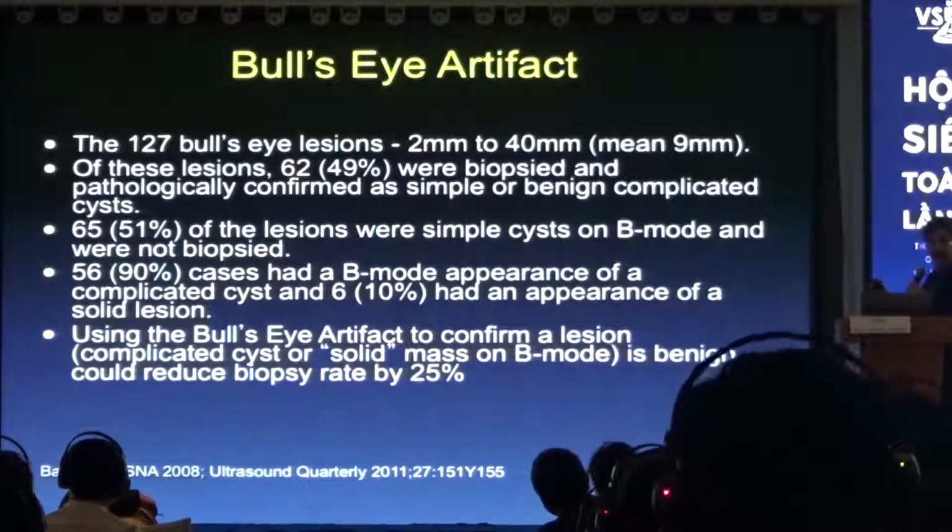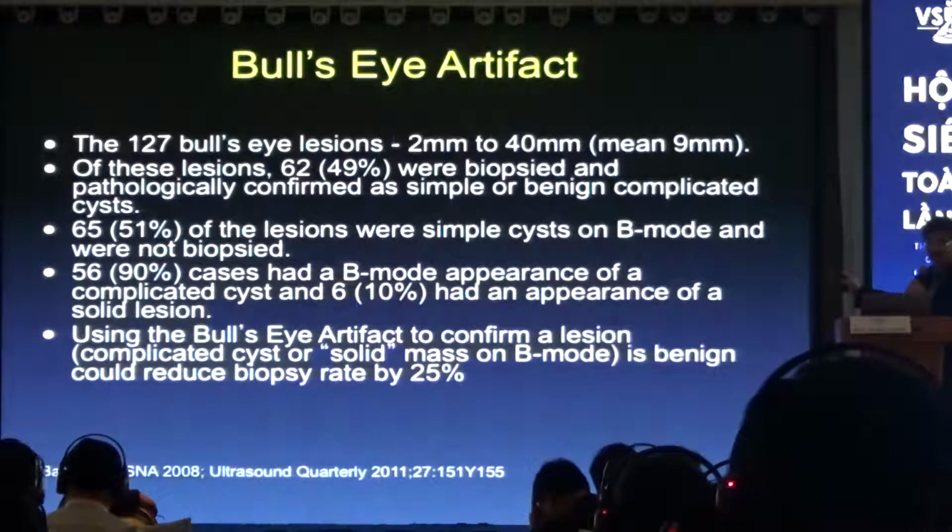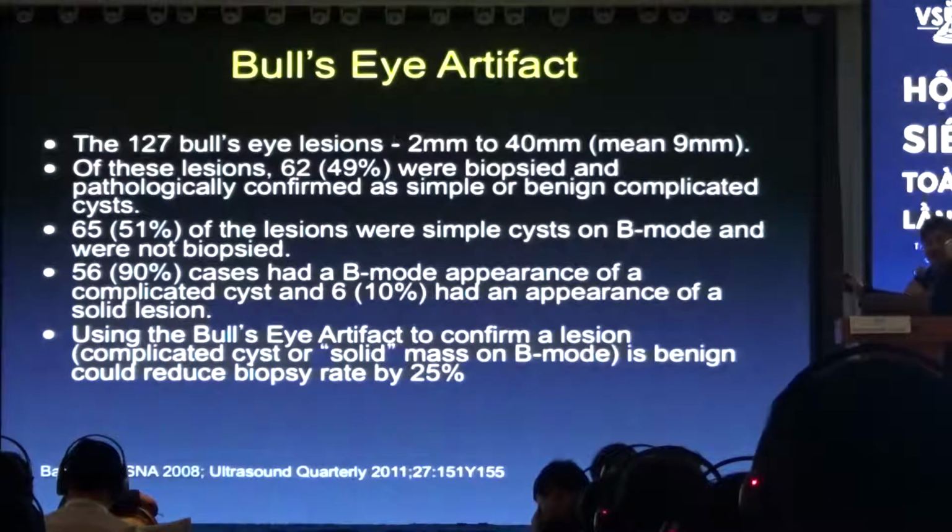And you'll see as we go through this talk and I show you how we've progressed, you'll notice that on that first study, our positive biopsy rate was about 20%. And you'll see now in our latest studies that our positive biopsy rate is 80%, because we've stopped doing biopsies in a lot of lesions that are benign.